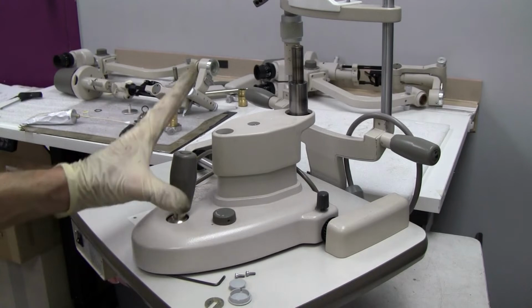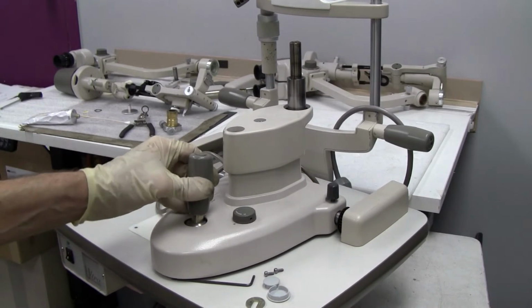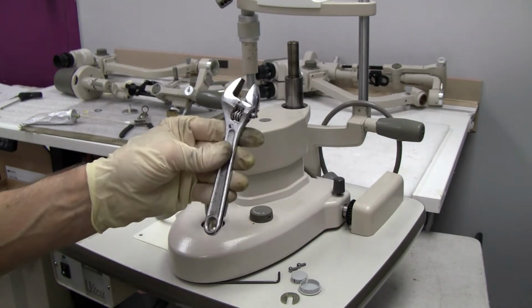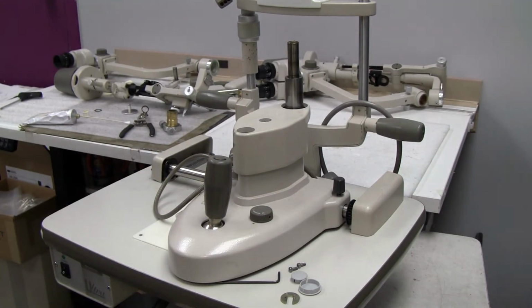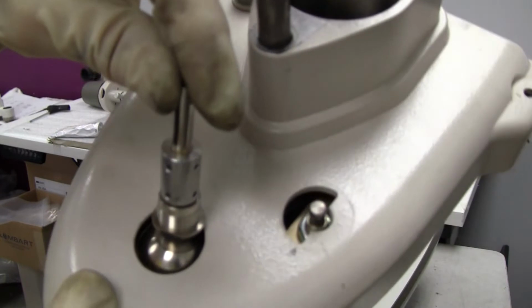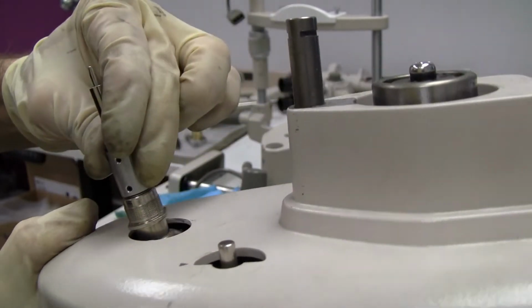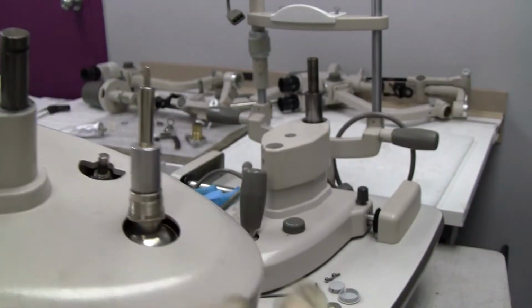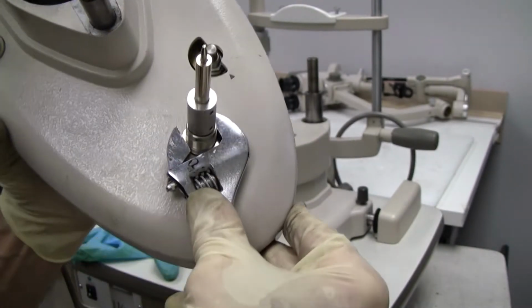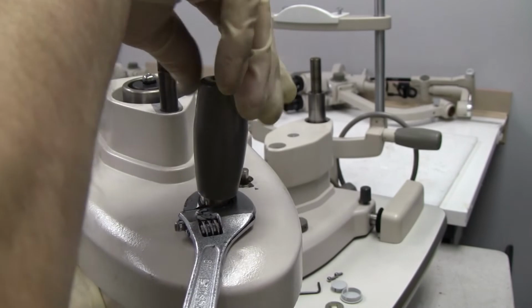If you're going to be taking the base apart, you're going to need to take this handle off. And the only way that I have found to do it, small crescent. And underneath here, you'll see little straight edges right on the sides. And that's where you're going to fit your crescent wrench. You're going to fit your crescent wrench right on those. And that's going to hold the bottom while you unscrew the handle.